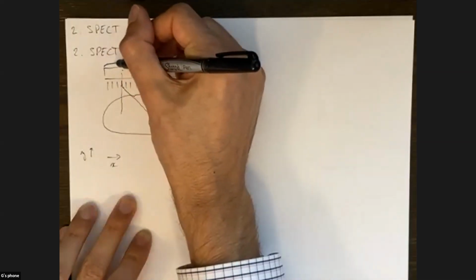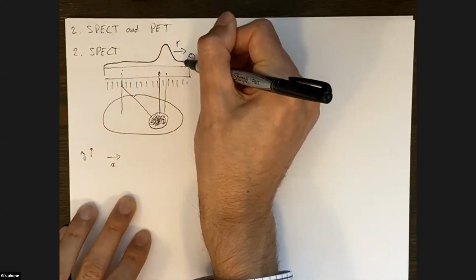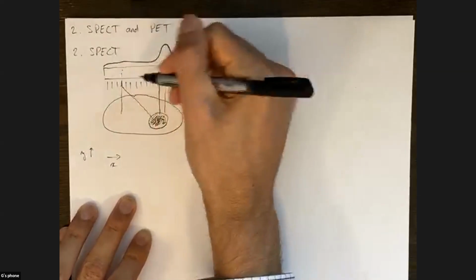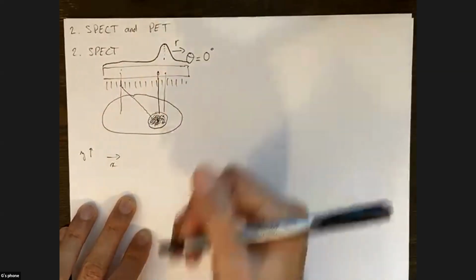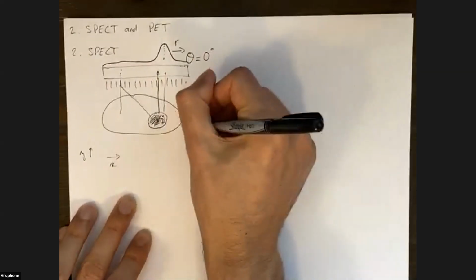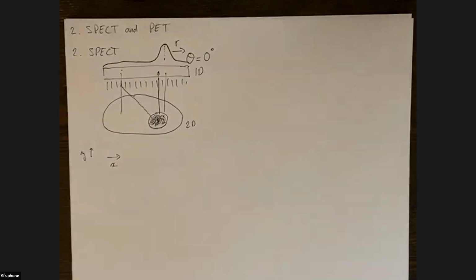Then we're measuring those projection data. Around here, there's basically few projection data, and here there's higher counts because of the tumor that's present. So this is essentially a graph showing the number of counts recorded for different points along the camera. At this point here, we're recording the most counts because that's the center of the tumor. This is the projection of the whole 2D image into a 1D projection. Of course, if I only have one projection view, there's not enough information to recreate a two-dimensional image. It's just impossible to go from a 1D projection to a two-dimensional image.